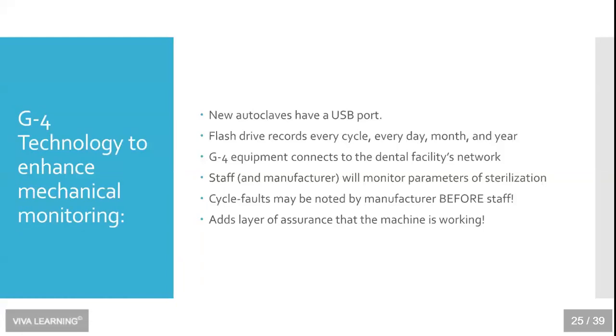And it's kind of interesting to see that some dental facilities will receive a phone call saying, you've got a problem with your autoclave. The front desk personnel may say, no, we don't, it's working fine. And the manufacturer may say, yes, you do. You better check your mechanical monitoring because we're noticing X, Y, and Z.